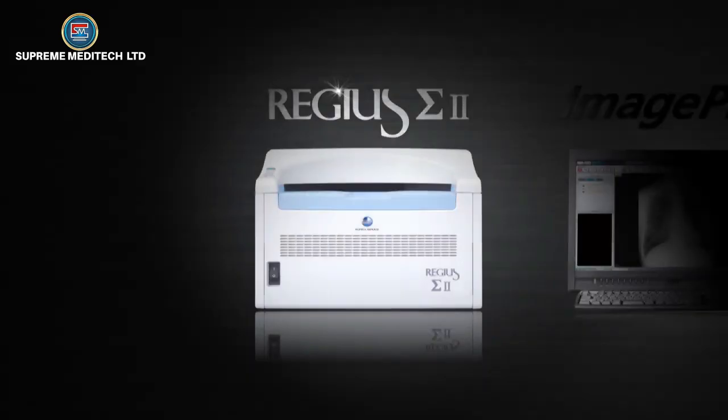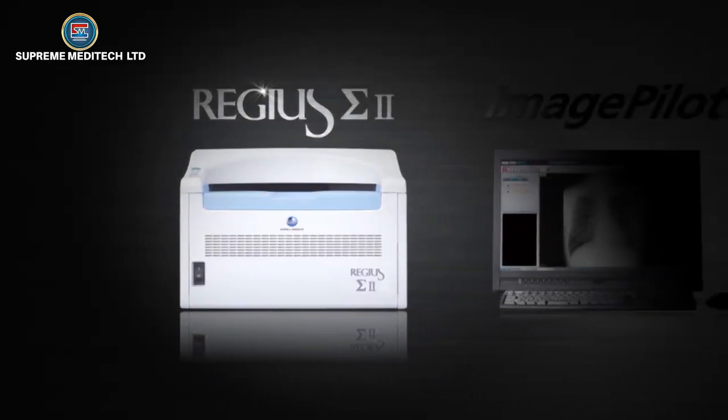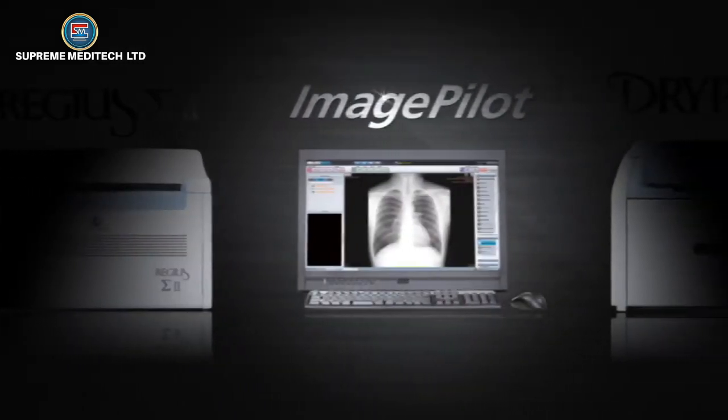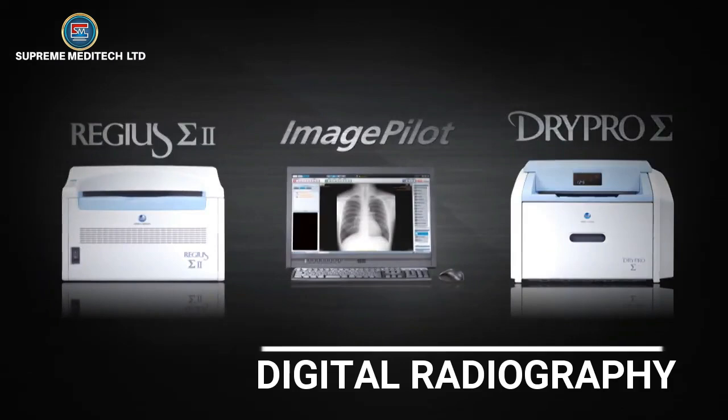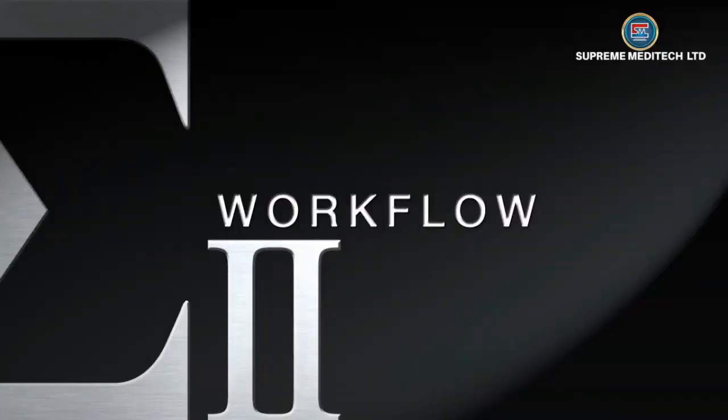Konica Minolta's smallest and lightest CR solution, the Regis Sigma, ImagePilot, and small but powerful laser imager DryPro Sigma provide a simple yet versatile transition to digital radiography, all in one workflow.